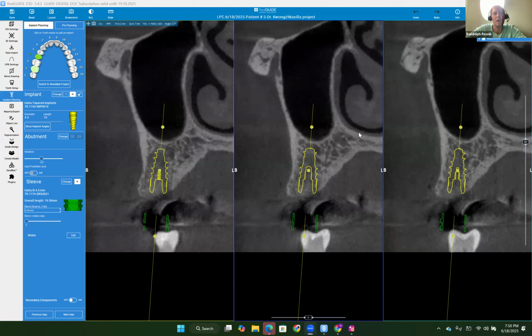It's just you're not going to have the best bone quality down there. So when you're going down there, sound the walls to make sure you have solid bone surrounding the implant. To feel it, you would use the smallest curette, similar to when you're extracting a tooth and you curette the wall to remove the soft tissue. Just go down there and make sure you don't have any soft tissue still underlying.